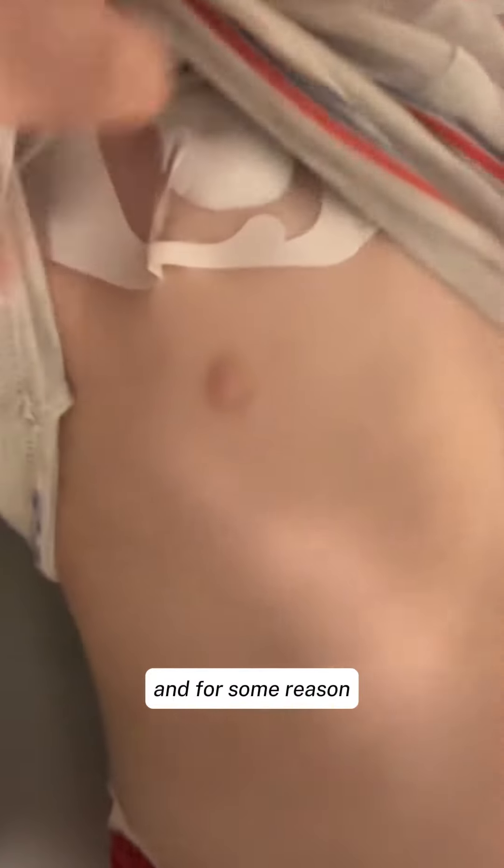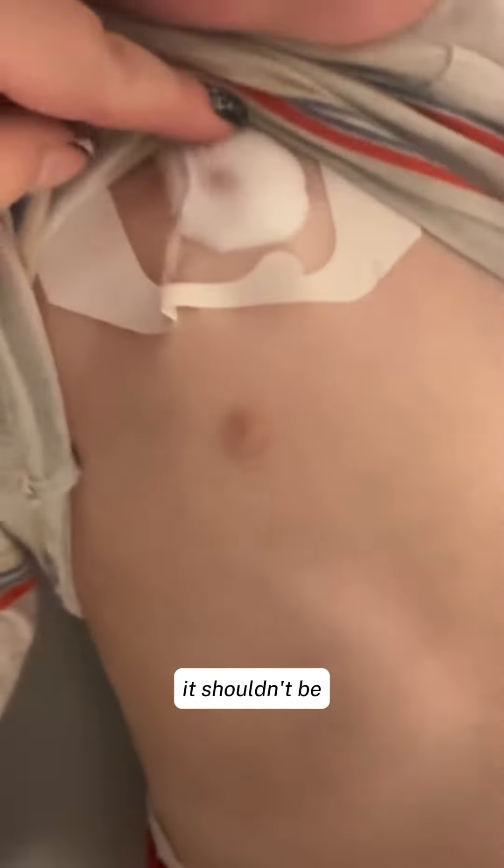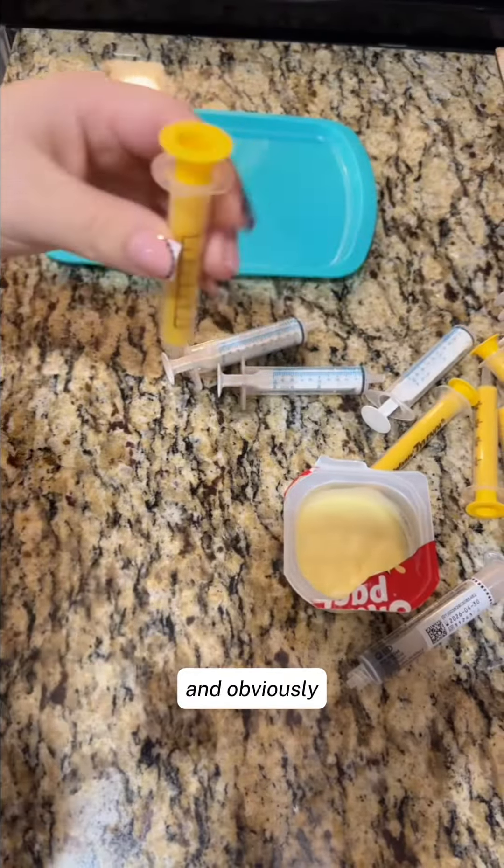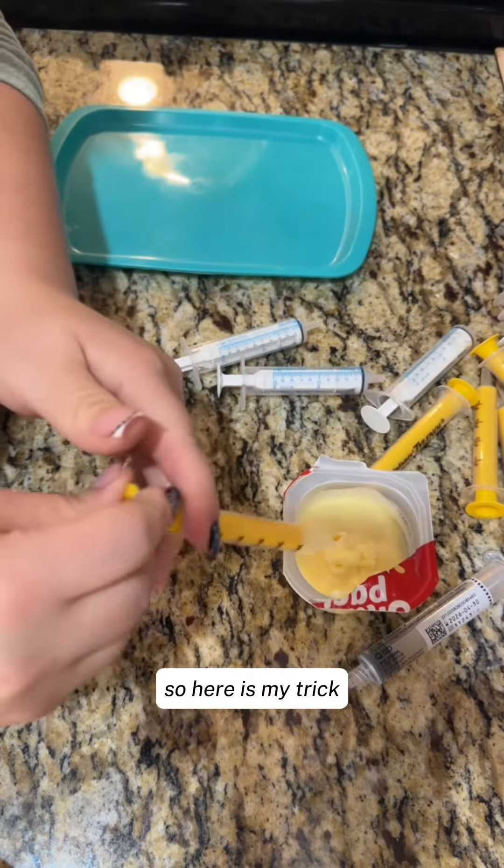I go ahead and put the numbing cream on the port implant, and for some reason he still doesn't really like this — it shouldn't be painful. It could just be because the cream is cold. I make sure it is stuck on there because it has fallen off before, and obviously we want it to be numb. So here is my trick.